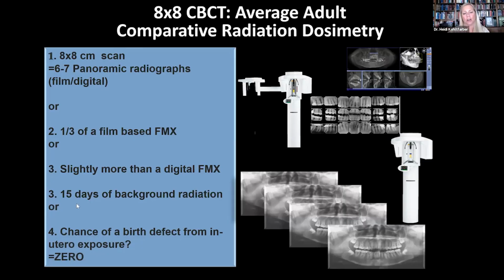It's about a third of a film-based full mouth series. So those film-based full mouth series were quite a lot of dose. So I can take 3 CBCTs for one of those film-based full mouth series. So if you ever took a film-based full mouth series, if you are that generation like I am, that was so much dose that your CBCT is about a third of that in comparison. So, and from that standpoint, I would not necessarily be very concerned about dose. We can say it's slightly more than a digital full mouth series.